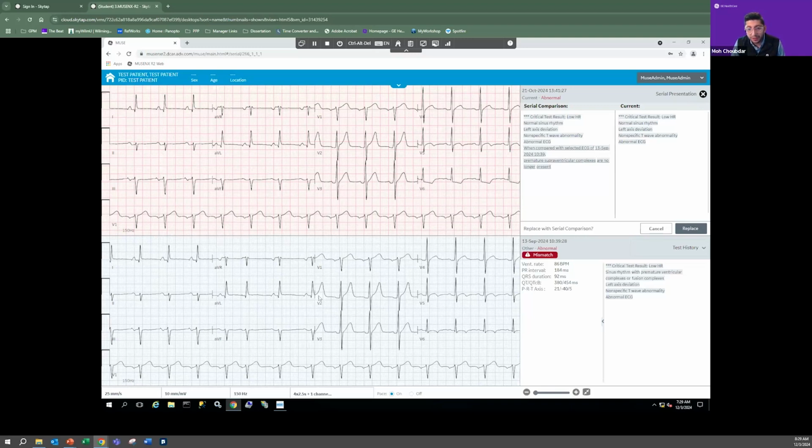It says, if an ECG was wrongly uploaded to a different patient, can it be deleted or edited from the web client? It goes exactly with the previous answer. So within the edit, we are also bringing the deleting from the web client. That's certainly something we're working on to bring to our web client. So we expand from the physician workflow to more of a technician workflow, and things that you can do to edit patient information.